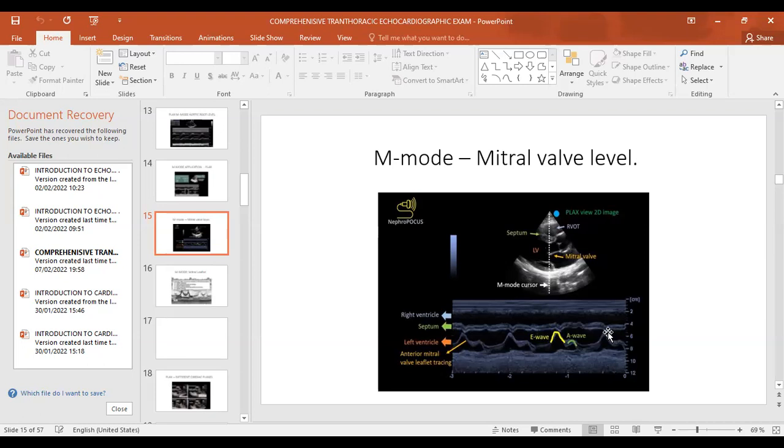So for me, when I'm doing an echo, I'll do this EPSS, and I'll even know that I'm dealing with a normal ejection fraction. I don't expect to get an EPSS of, for argument's sake, maybe 16 millimeters or 1.6 centimeters, and then find an ejection fraction of maybe 70 or 60. Then there must be something wrong.